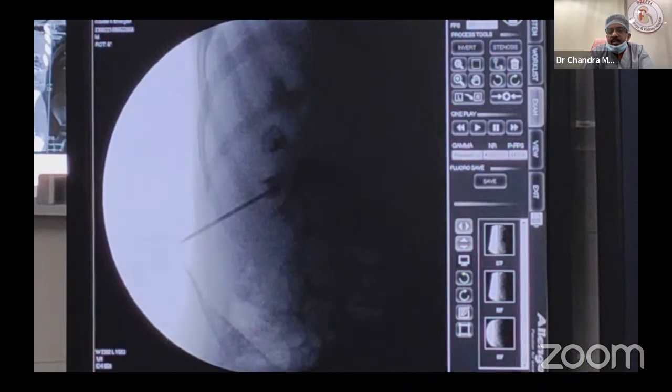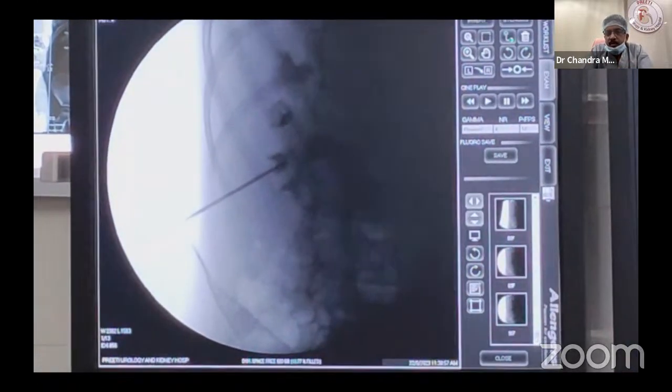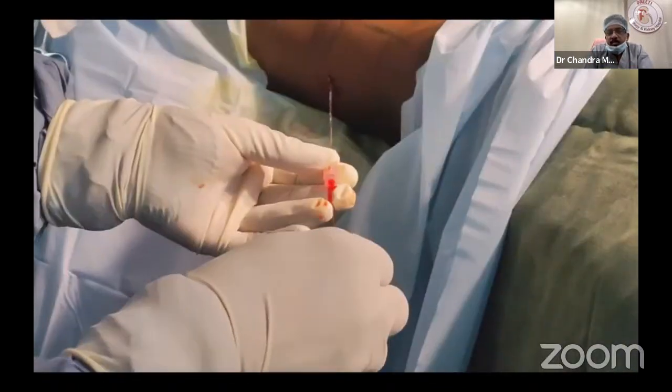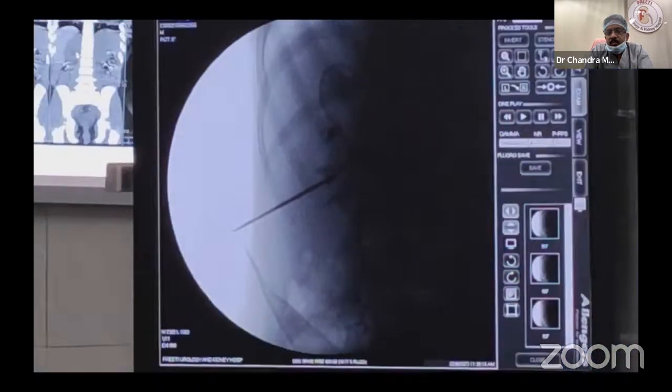Now, see, periphery. This is the most important thing, that the needle tip has not gone into the pelvis, has not gone into the infundibulum. Then it is very, very safe. Then you can pass the guide wire where disastrous injuries will not happen. A few millimeters from the cup in the calyx usually does not cause torrential bleeding. After entering also, we should be careful. While dilating also, we should be careful. At the tip of the periphery, it is unlikely that a major vessel will be hit.